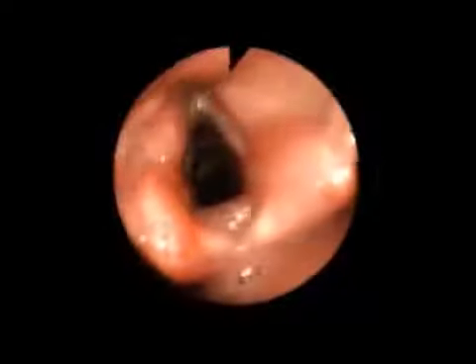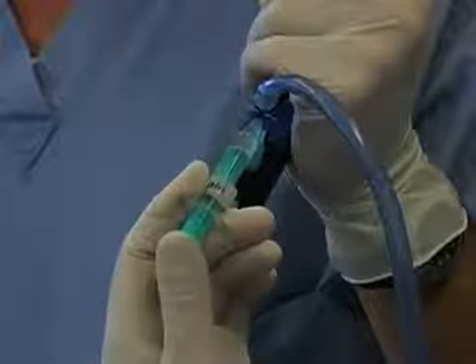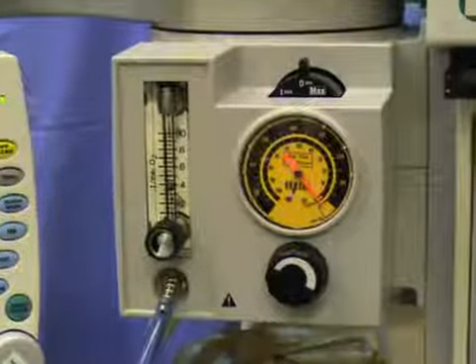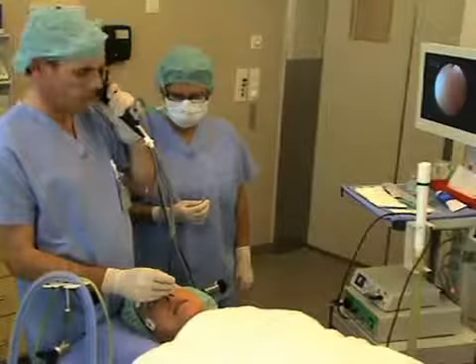At the supraglottic region, introduce 1 to 2 milliliters of local anesthetic through the working channel of the fibroscope while administering oxygen to propel the anesthetic into the area. Advance the fibroscope posterior to the epiglottis and through the vocal cords, taking care to avoid any direct contact with the pharyngeal and laryngeal structures.